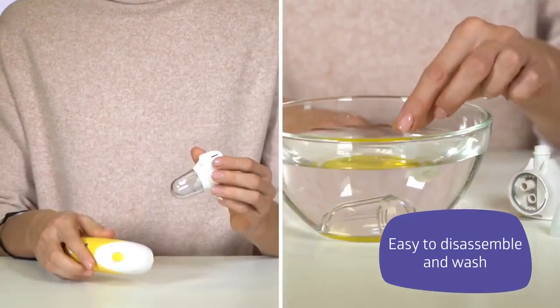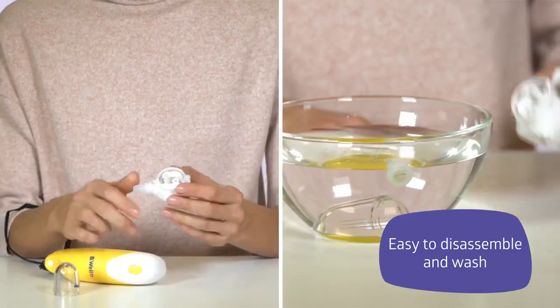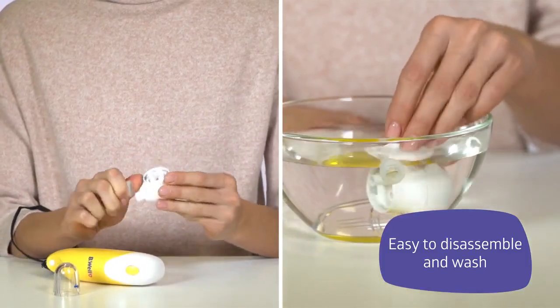Disassemble the device. Flush the connection module, collection cup, O-ring, and tip with warm water and mild detergent.